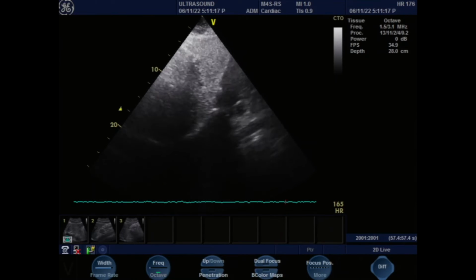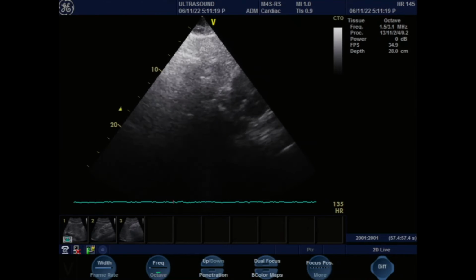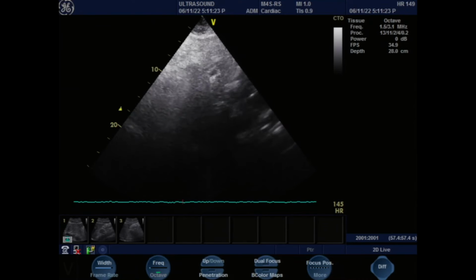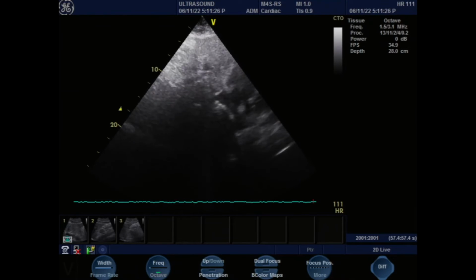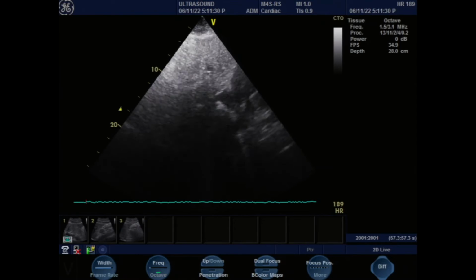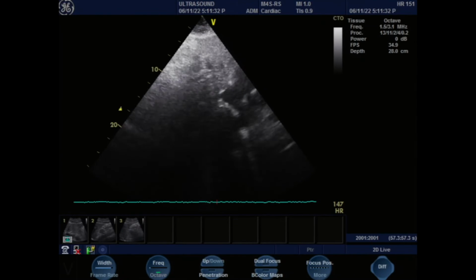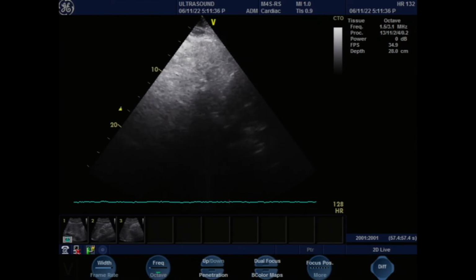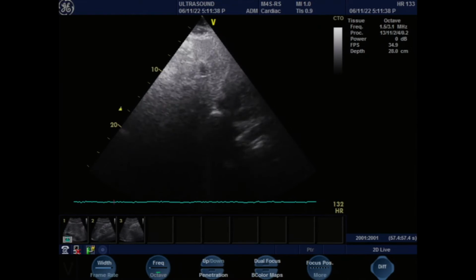Okay, anyway, so we only see a little bit of it right there. It's very small. Usually, if it's heart failure patients, they're full of volume. It's going to be big, about 2.5 centimeters. I think he's probably not even going to be 1.5 centimeters. So it's going to be very small and completely collapse. Just by pushing it down, it collapses. So he's just a normal guy.